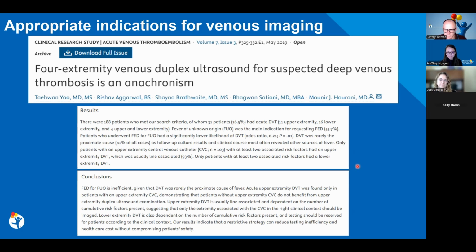When our sonographers reach out to the providers to get some clarity and get these down to the symptomatic extremities, we're often met with, we put the order in, just do it. So we loop in our radiologist at that point to try to educate or get them down. But yes, it's a very long exam on critical patients.